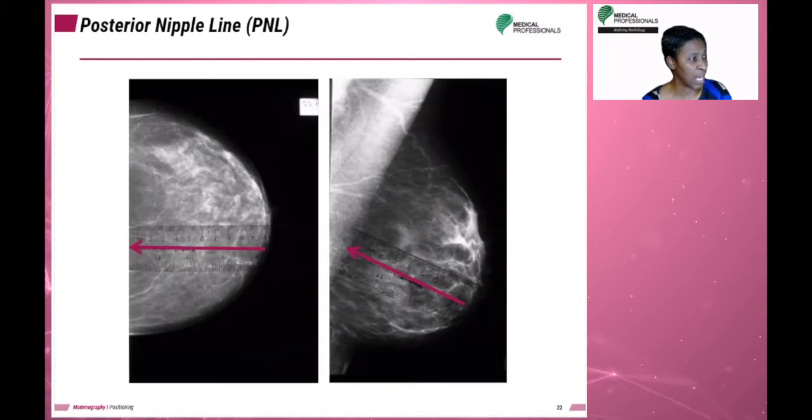When a patient with a mastectomy comes in, is it desirable to do an MLO of the operated side to see if there's any residual tissue in the pec muscle? As I said before, it's possible. It depends on the protocols of your facility, so this is something you would check with the radiologist.